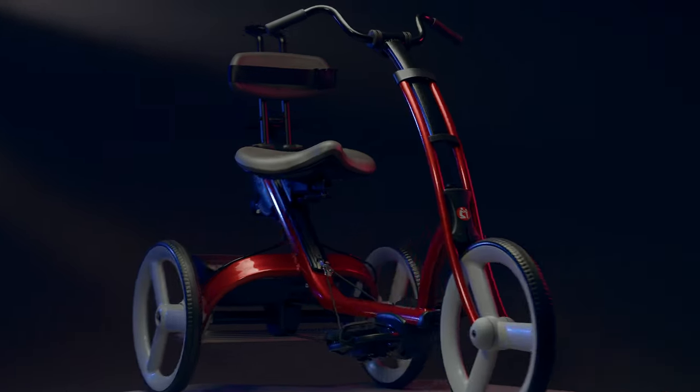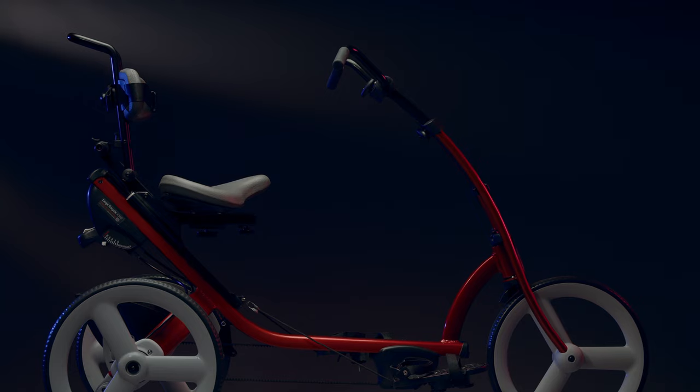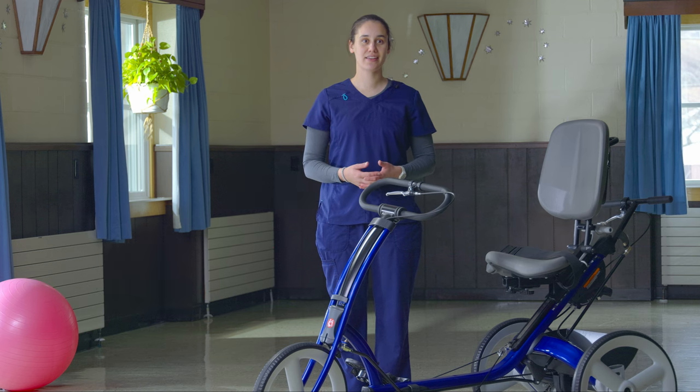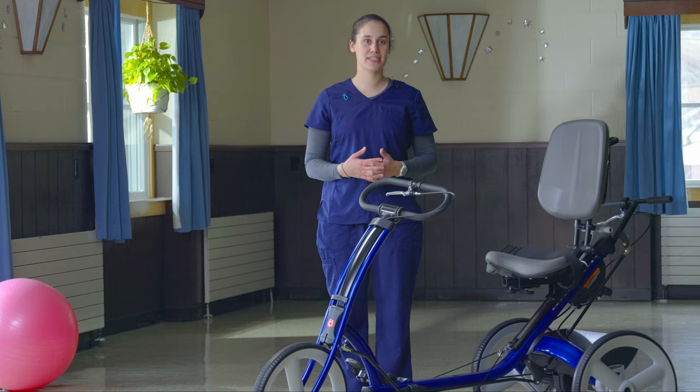Here is Rifton's adaptive tricycle. This is the large size, designed for users up to 310 pounds with an inside leg length up to 38 inches, which is equivalent to the height from the pedal to the seat.